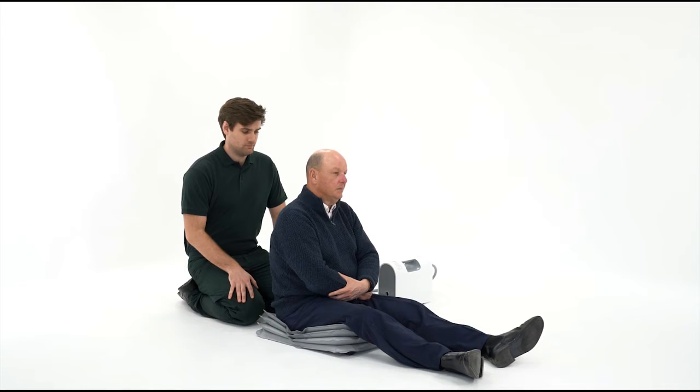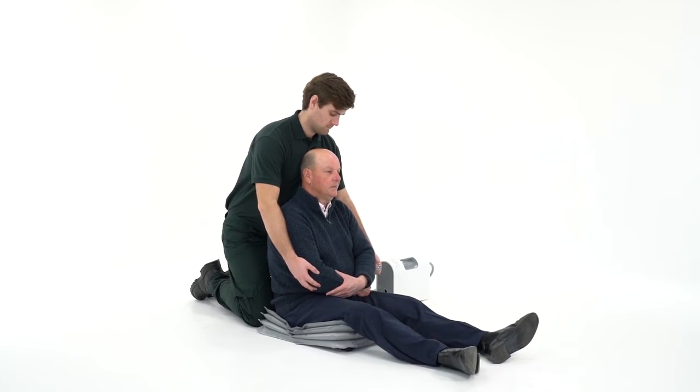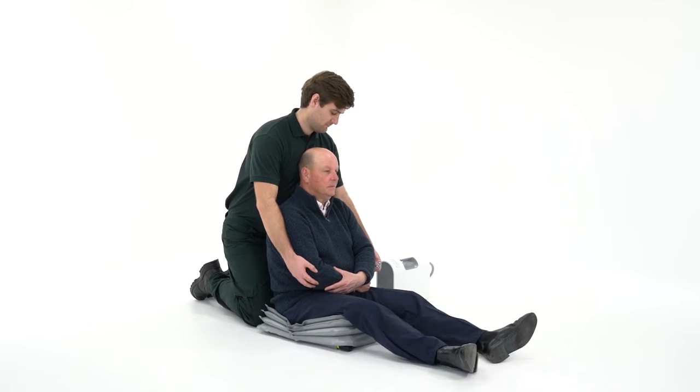Ideally, the person needs to be sitting centrally on the Elk as close to the back as possible. The person should then fold their arms whilst maintaining a good posture as the paramedic provides support. It's essential the paramedic supports them from behind and remains there for the duration of the lift.